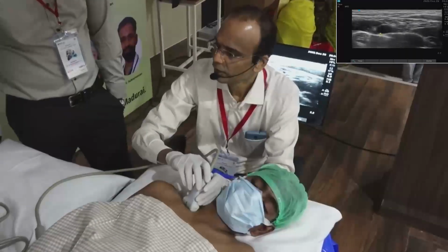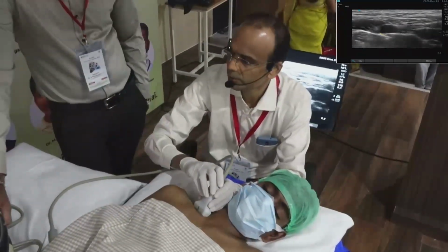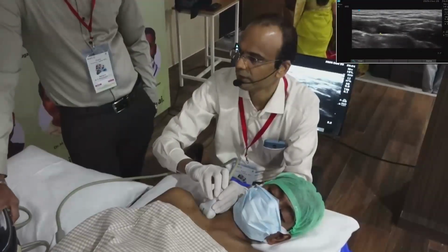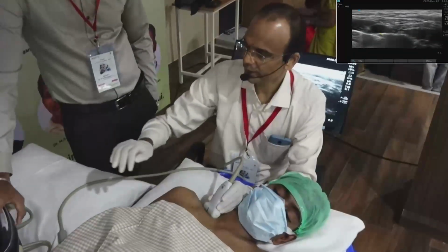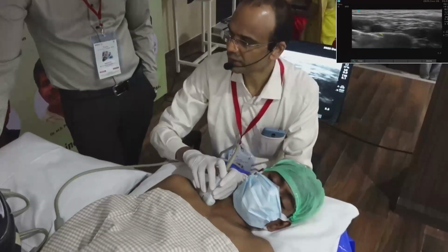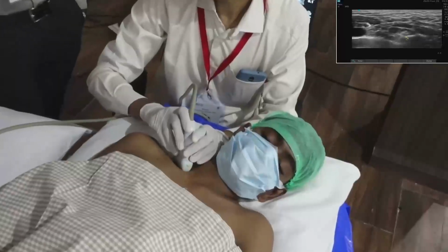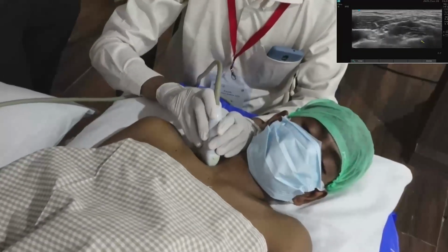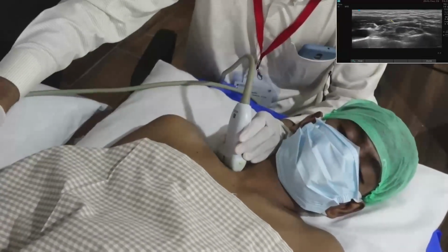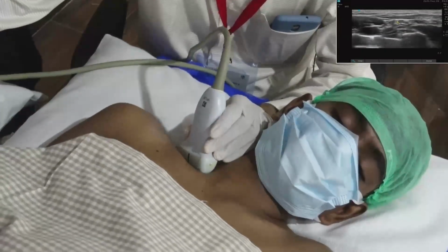Now, the subclavian perivascular block is routinely called the supraclavicular block. So I will move on there. Here we see mainly trunks and divisions. If you come here, we can see the upper trunk. So this area corresponds to the upper trunk.